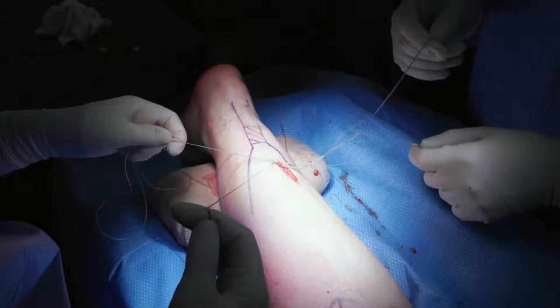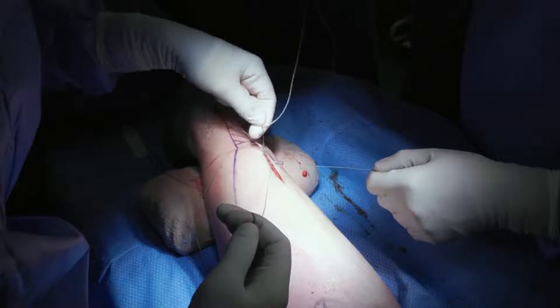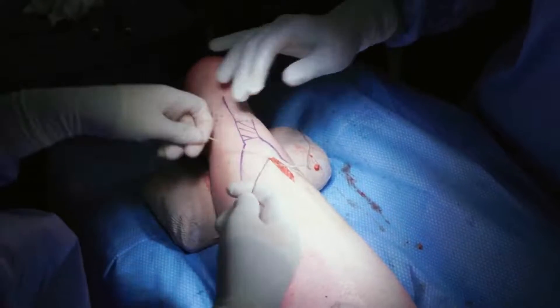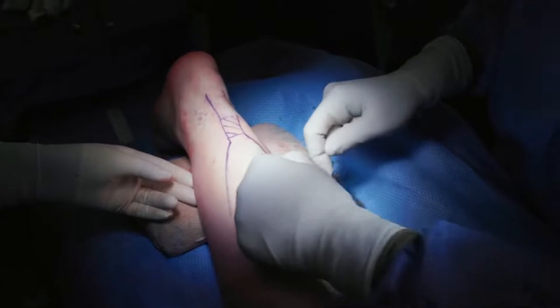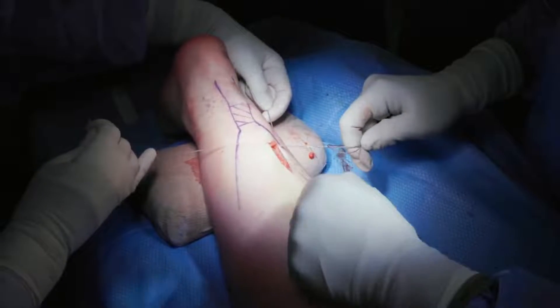The non-looped end of suture number 3 or 4 is then pulled on each side until the suture is removed from the limb. In spanning the paths previously occupied by sutures number 3 and 4, suture number 2 is now a locking suture. Pulling on both ends of suture number 1 demonstrates its sliding nature, whereas pulling on both ends of suture number 2 shows no sliding — it appears fixed due to the locking configuration.